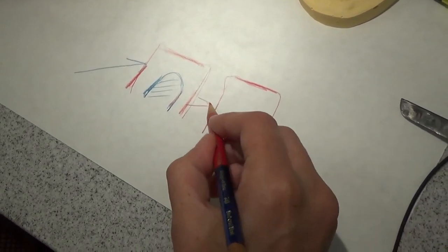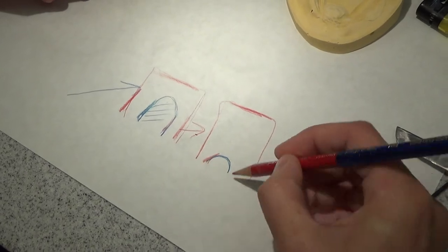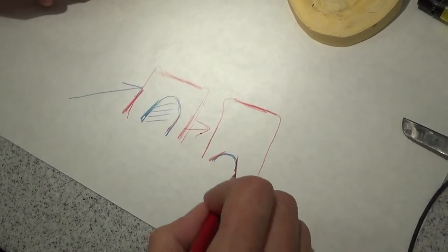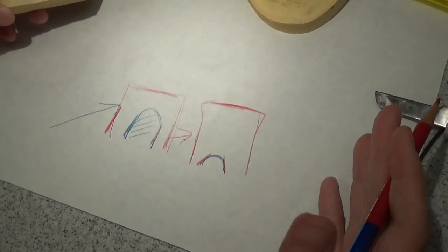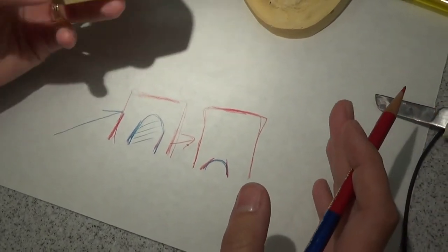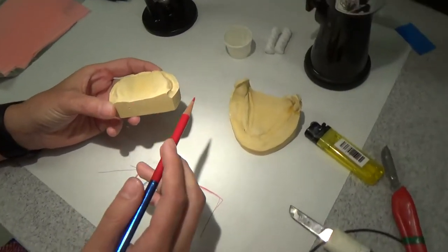More resorption. When I put force here, this little angle, this non-parallel tapered wall with this same denture is not going to be very stable or retentive. So this is the situation that I'm dealing with here.